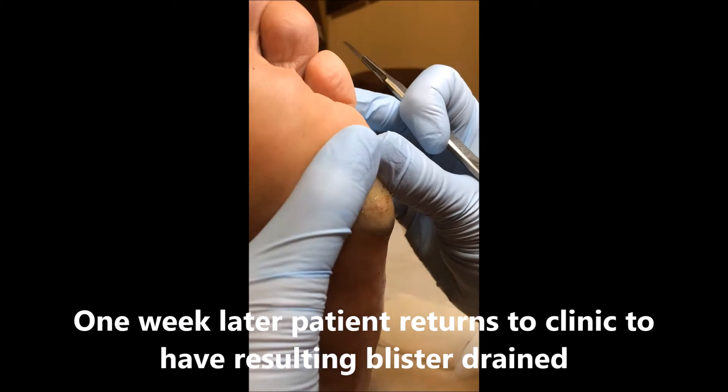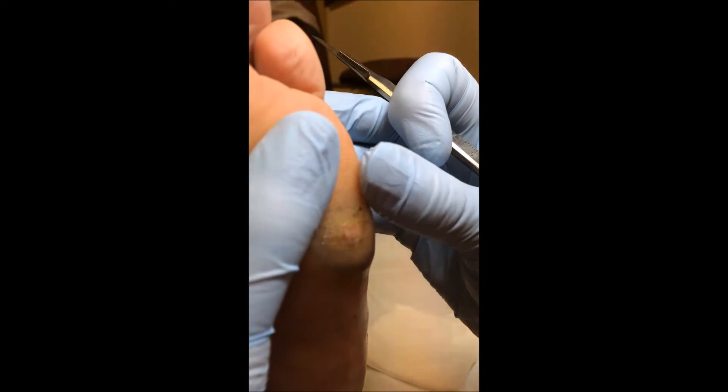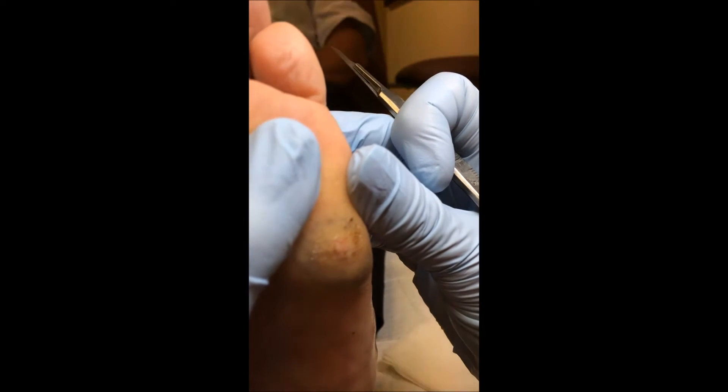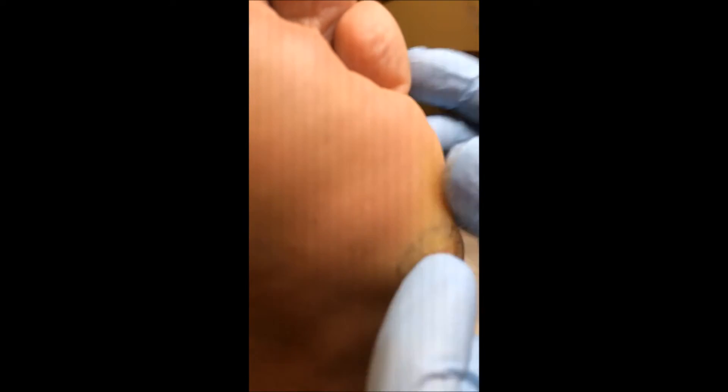This is a gentleman who had a case of very bad plantar warts, and these were lasered with the ND-YAG a week ago. You can see the nice blistering around the area, and I'm just about to drain some of that excess blood product out.